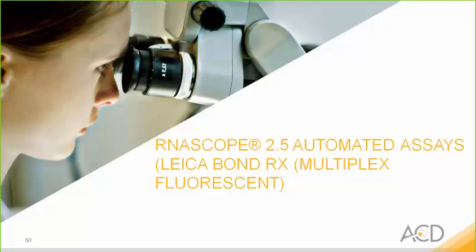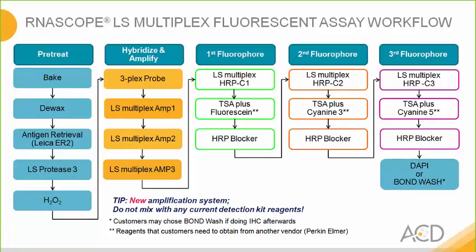Recently released, we also have the LEICA Bond RX assay for multiplex fluorescent. You'll see in this workflow that you're developing each channel sequentially with a blocking step after each fluorophore. This also introduces TSA as part of the amplification system that would need to be purchased from another vendor, PerkinElmer. Please note that you may also choose to complete IHC afterwards, in which you can do the bond wash step in place of DAPI. For further information on completing RNAscope ISH and IHC, we do have some information on our site, and you can also feel free to contact technical support.